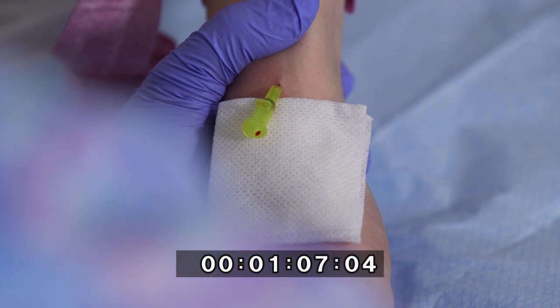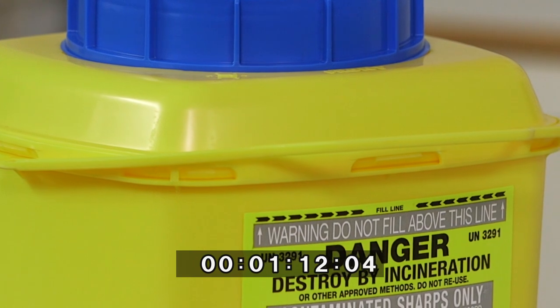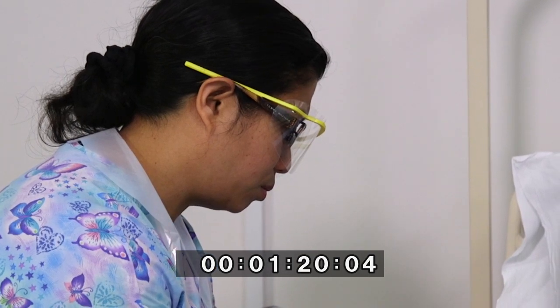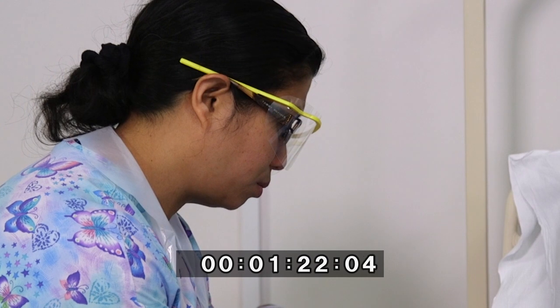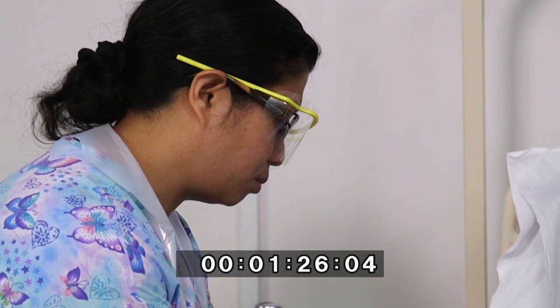She applies digital pressure to the vein above the cannula tip. She disposes of all sharps in the sharps bin at the point of care. If blood collection was required at this stage, Nurse Emma would connect with the appropriate safe blood collection system and adhere to ANTT and venipuncture guidelines.